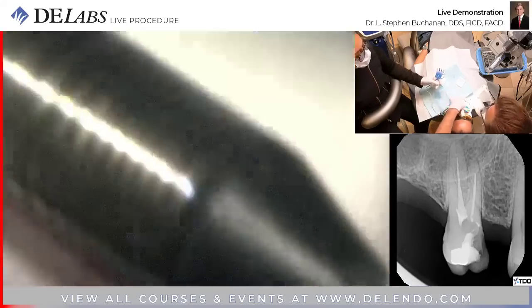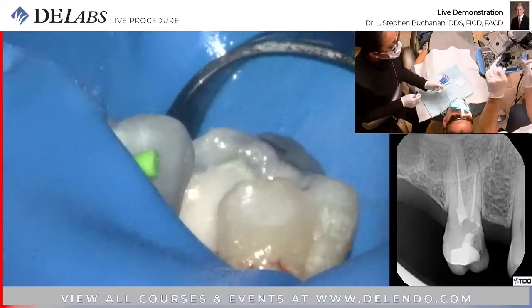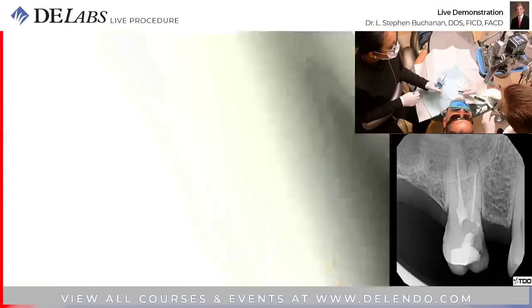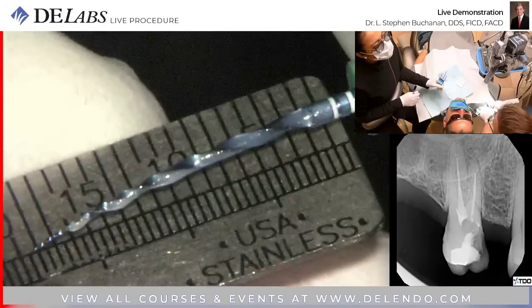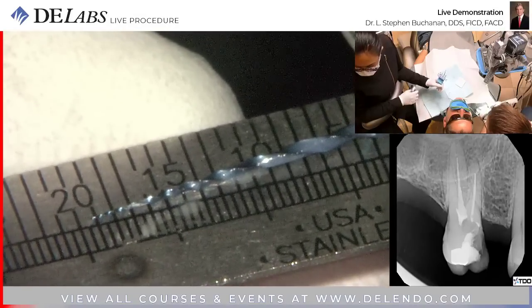And then I get a little lever arm there, and we're going to measure it. Length in the distal buccal canal by the palatal cusp tip is 19.5 millimeters.